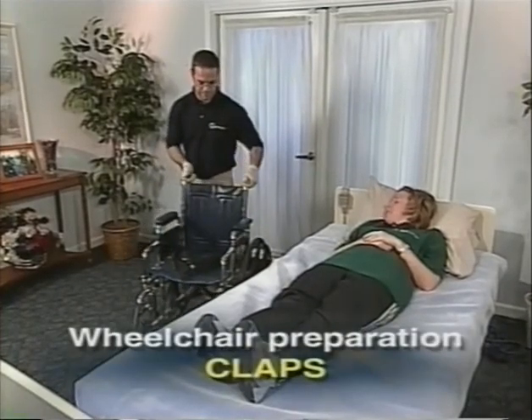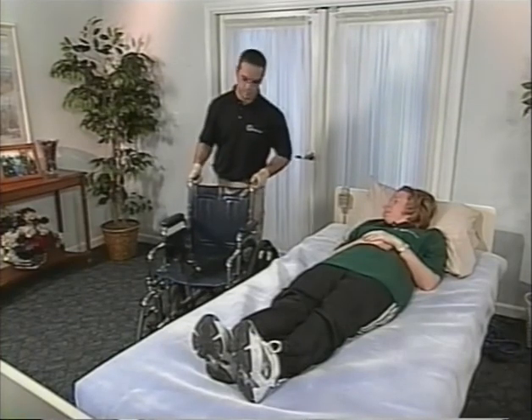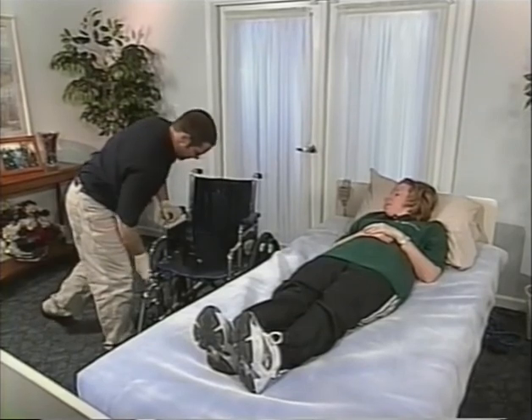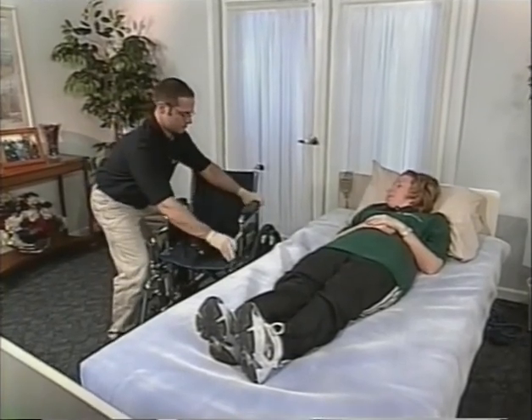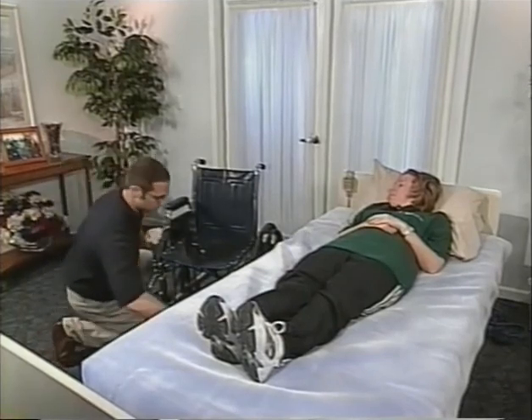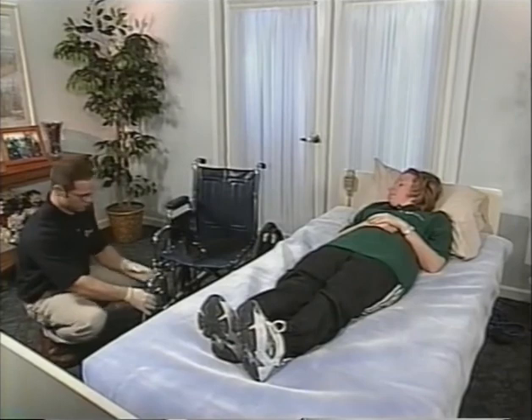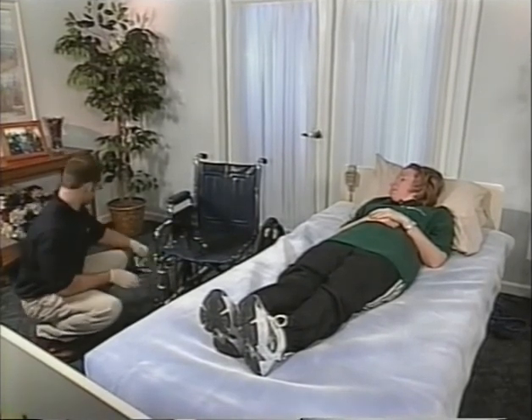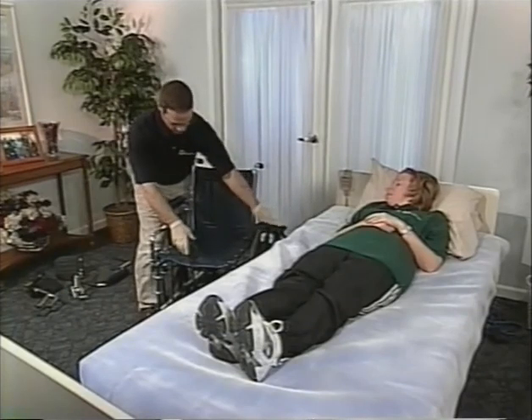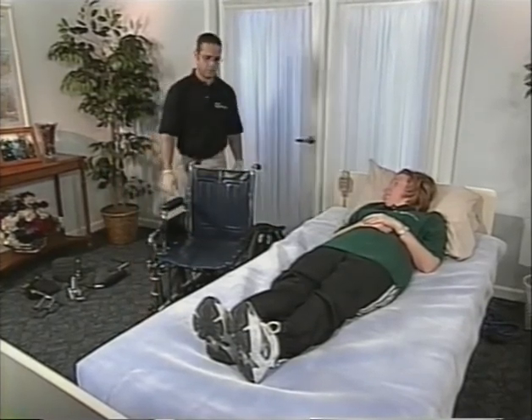First, perform wheelchair preparation. Use the acronym CLAPS to recall the steps. Position the chair, lock the brakes, remove the armrest, remove the foot plate, place belts and straps in optimal positions for easy access after the transfer.